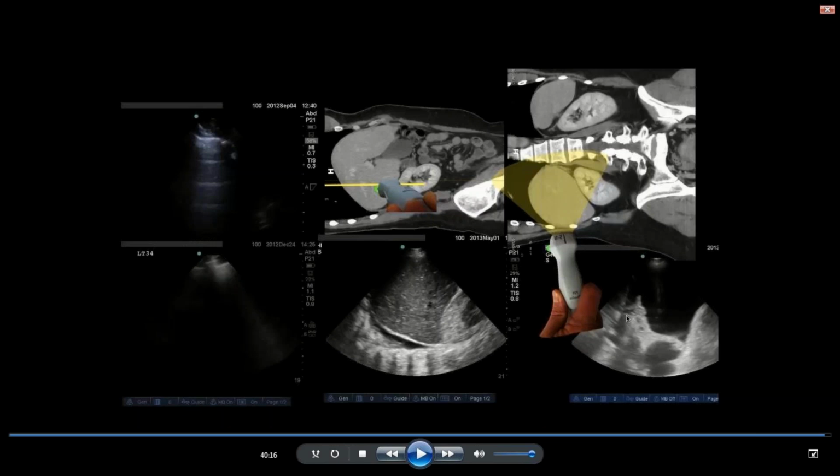Thank you, Dr. Blaivas, for sharing that study in 2005 that was published in Chest. And actually, if we go back to what they described, that was a typical Hampton's hump, which we were taught in medical school as a pleural-based wedge-shaped opacity to look for in chest x-ray in someone suspected to have PE.